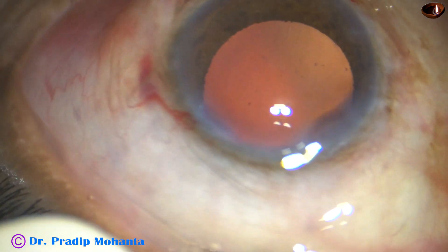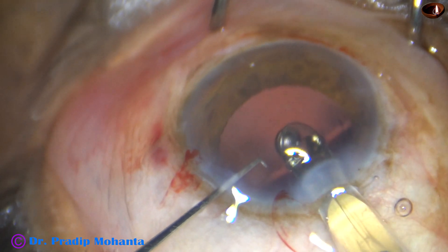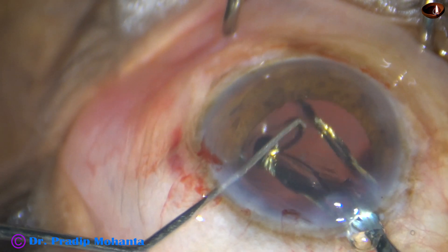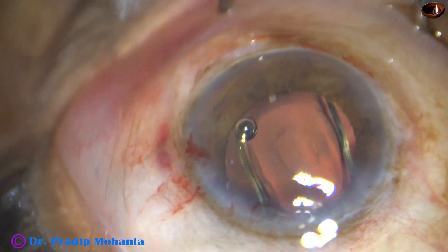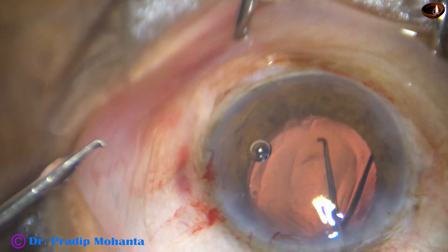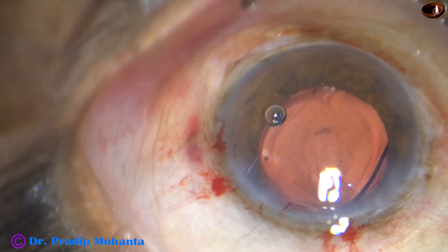The posterior capsule appears very clean and now is the time to implant an intraocular lens. In this case, I have selected a hydrophobic acrylic monofocal single-piece intraocular lens with yellow tinge. Here goes the lens — the leading haptic goes into the capsular bag and the trailing haptic goes into the capsular bag. The lens is dialed and confirmed to be in the bag.